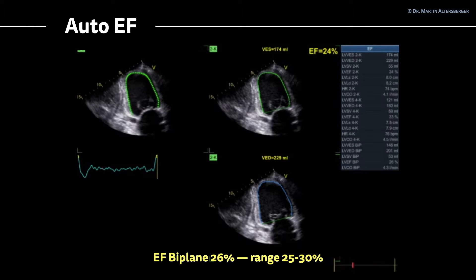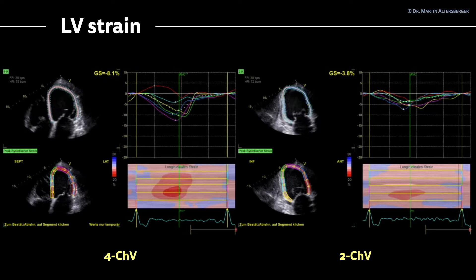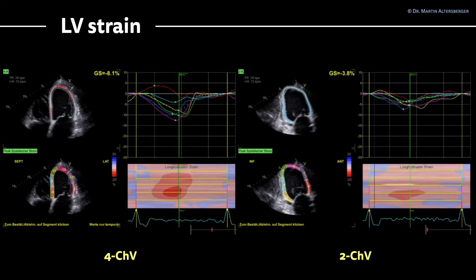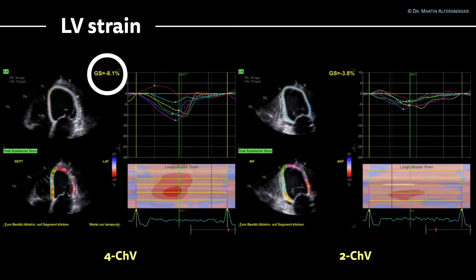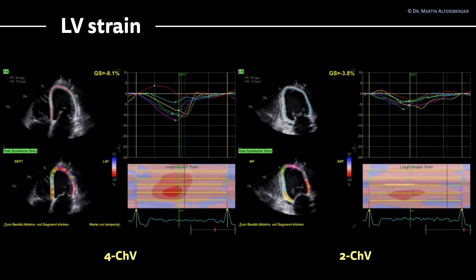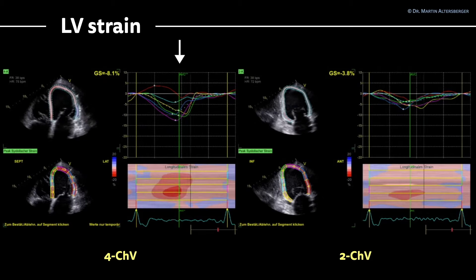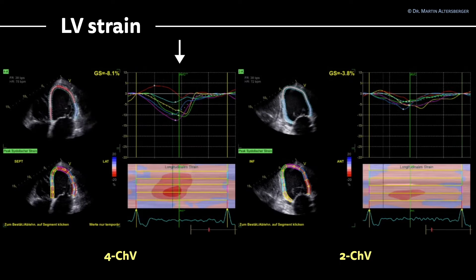So we have a case of HFrEF. Looking at strain imaging, LV strain in the 4-chamber view is also severely reduced. The global strain written in the loop is minus 8.1%. Remember that the normal value is in the range of minus 18 to minus 20. Looking at the curves, there is some contraction present, but in one segment — the red segment — there is even dyskinesia present.